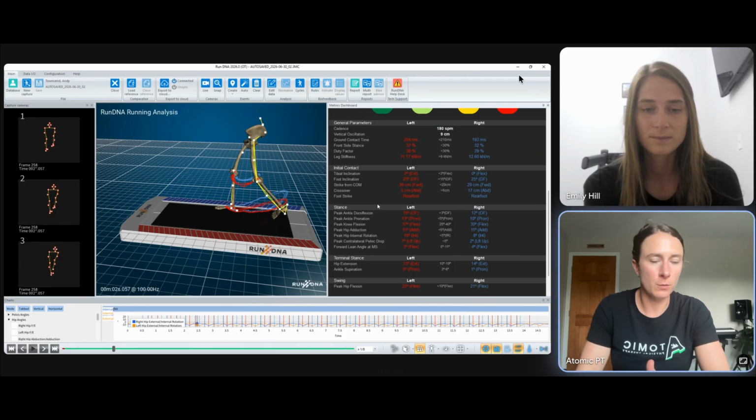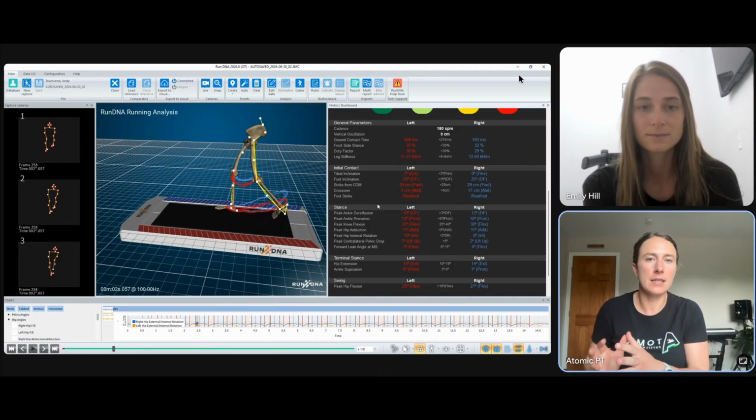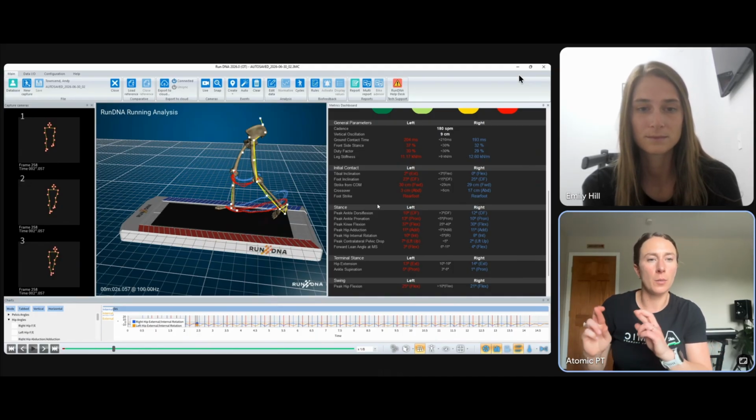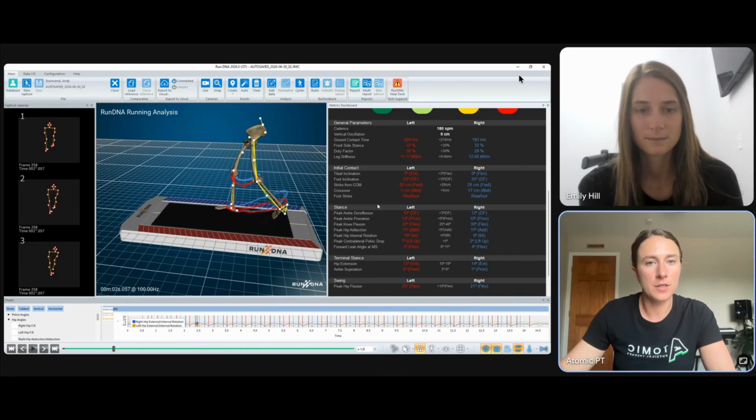So it sounds like precision. We're getting more of that precision on site in the appointment, and like you said, while there is some trial and error, it's not in the same way as you just going home and hoping for the best. It's more based on all of this data and all of the things you've seen and have been able to interpret with your expertise.